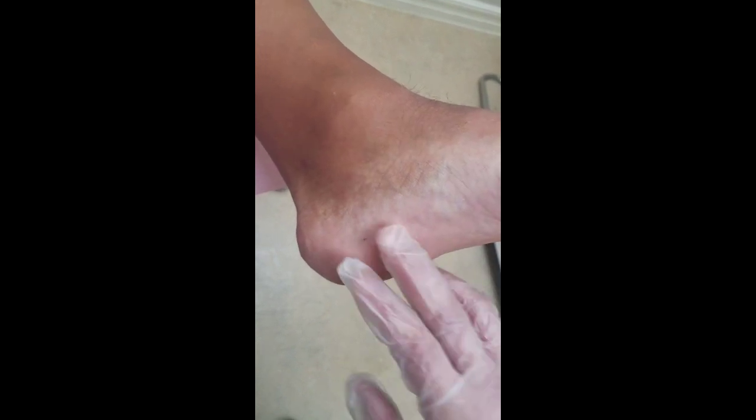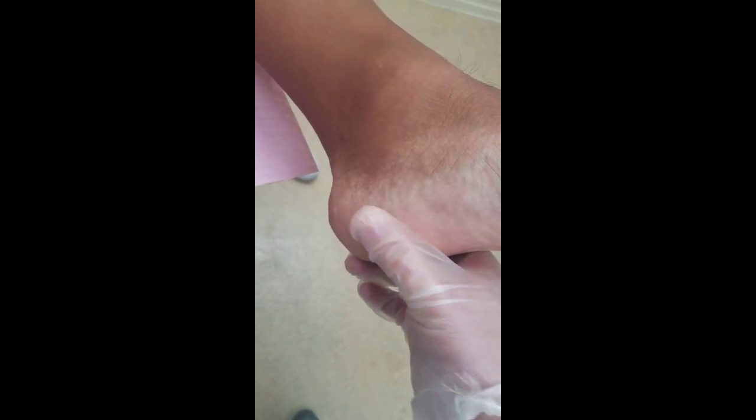This is our second patient that we did the TENJET on at the Family Foot and Leg Center. He had a lot of pain before that. As you saw with the first patient, the pain has decreased significantly. This is only 1 week. We used steri strips. We didn't use a suture on this one.